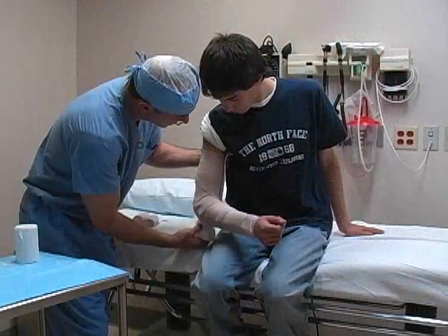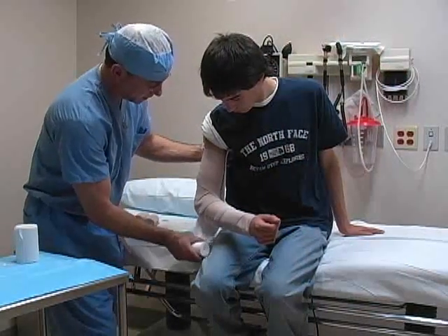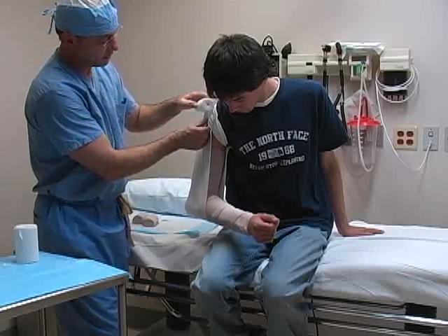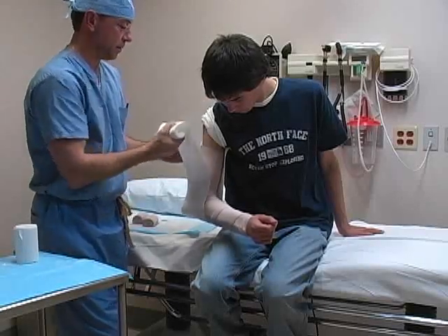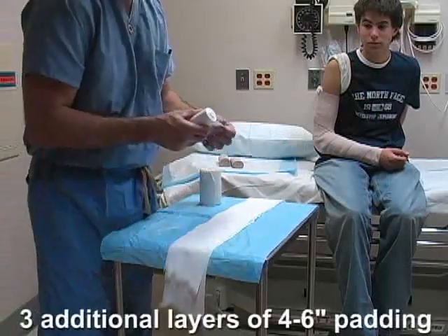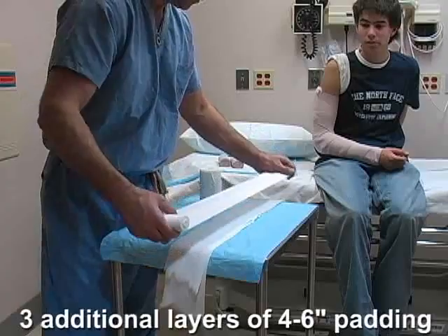Use a piece of webril to measure from the patient's axilla, down around the elbow, and then up the lateral aspect of the arm to the shoulder. Lay this piece of webril on a bedside table and then roll out three additional layers to form the cast padding.